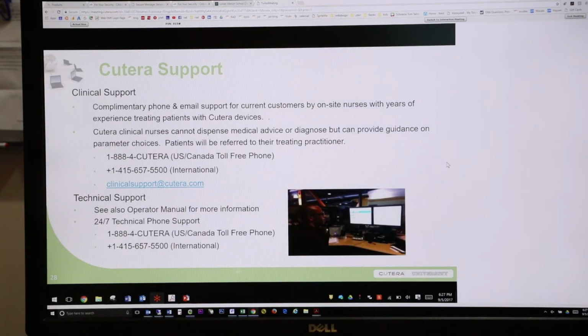So we always say it's half the time that it took to remove it with a Q-switch. So, for example, if the Q-switch took 20 times, then it would take 10. If the Q-switch took 10 times, then it would take 5. So it's a significant drop in the number of visits, but we can never promise an exact amount because we have to see the tattoo as it's progressing, and if it is progressing, the need for higher settings, etc., etc.